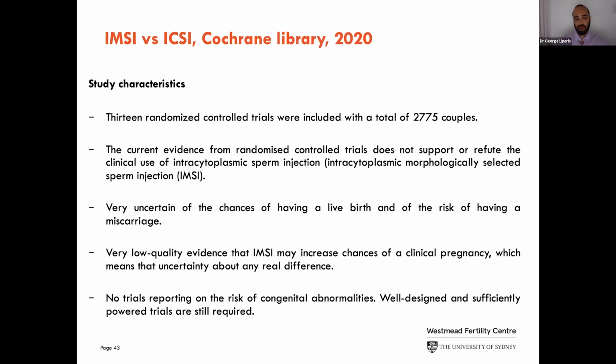miscarriage using this method. Once again, there was very low quality evidence that IMSI may increase the chances of a clinical pregnancy, which means that uncertainty about any real difference remains. And there were no trials reporting the risk of congenital abnormalities. So once again, no safety data with this comparison. Therefore, well-designed and sufficiently powered trials are still required for these comparisons to be made.